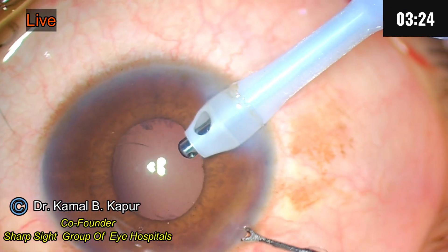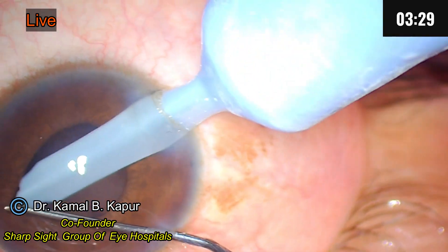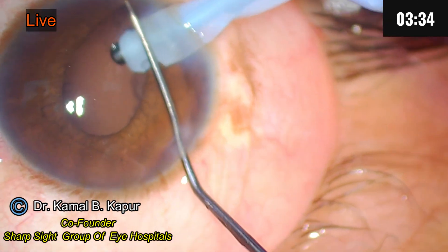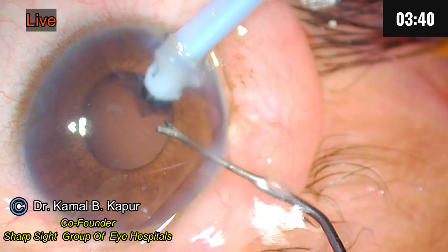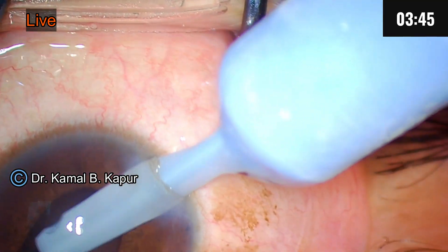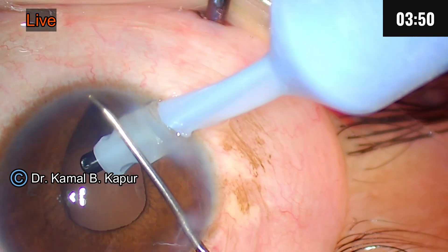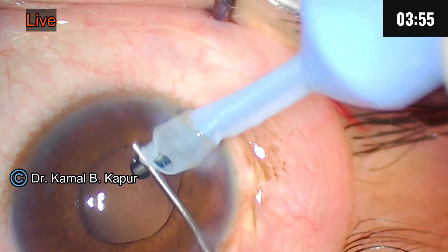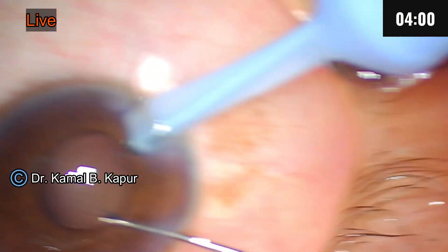This patient came to us with high ocular pressure. You can use your left hand to get better exposure. You can use bi-manual irrigation, but the only thing is that with bi-manual, sometimes you cannot get a very good exposure. We have now nearly cleaned up the whole cortical matter.